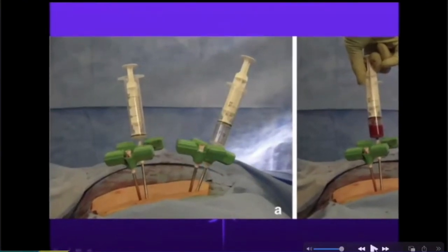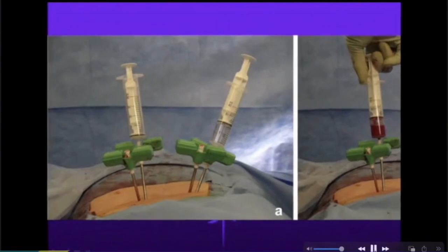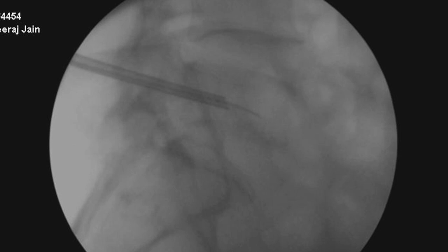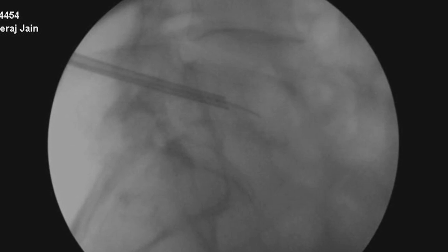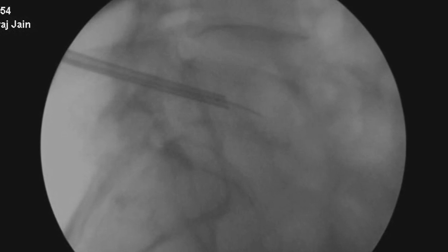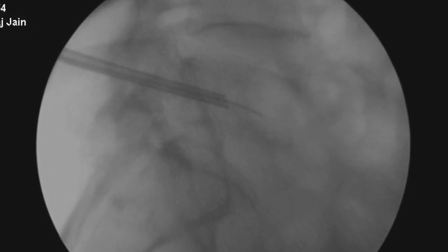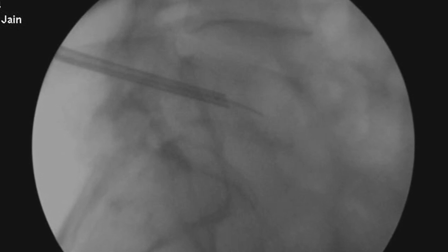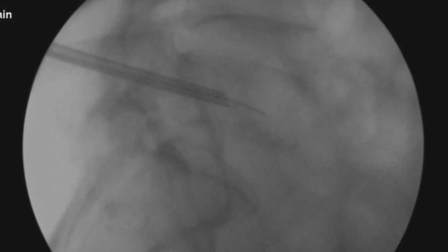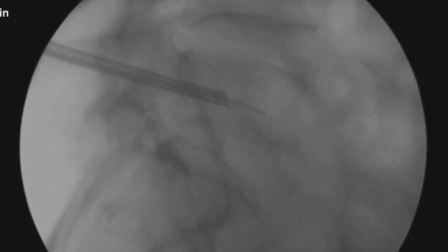If there are multiple fractures, the whole idea was to aspirate the bone marrow from the different needles before you inject cement in. Otherwise, the cement will get into the circulation and embolization will occur, which was the contraindication. Now, that's not the case. This is one patient who had a cancer also. Radiofrequency along with the cementing gives the best results, and with radiotherapy, cementing and radiofrequency give the best result in bony metastasis. So you might have to do a cementing for stabilization, but pain is a very, very important component and you have to take care of that.